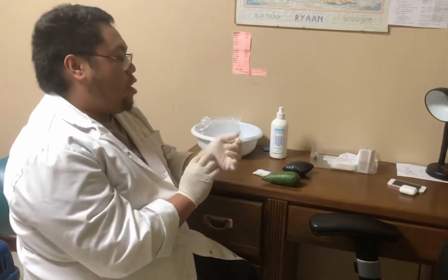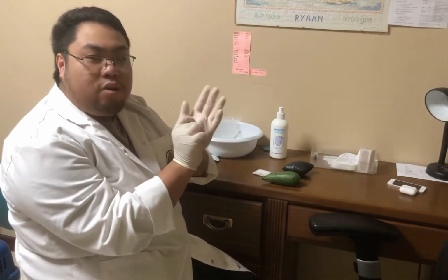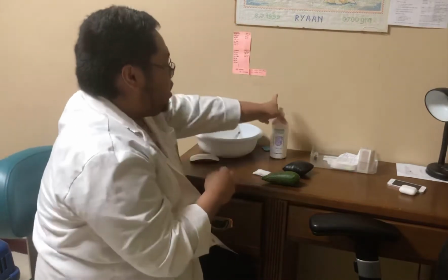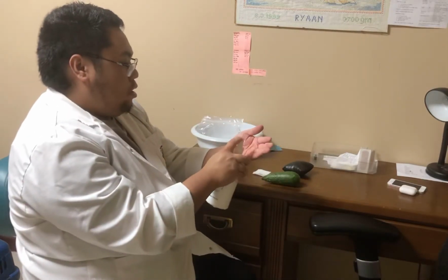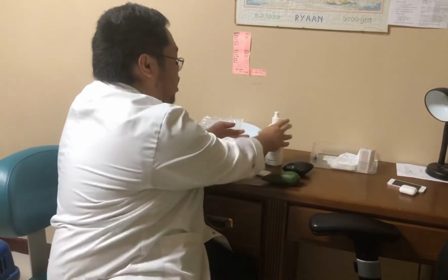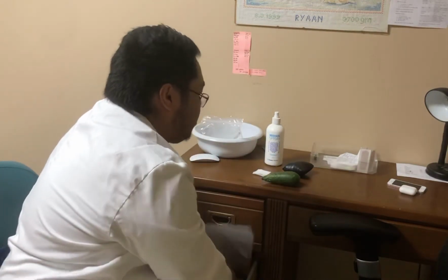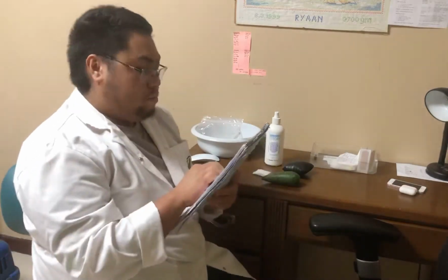So that's it for our RD. Lastly, remember to turn your gloves inside out, throw them in the proper area, perform hand washing, and chart pertinent data.